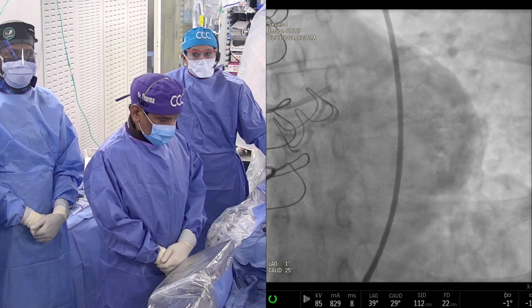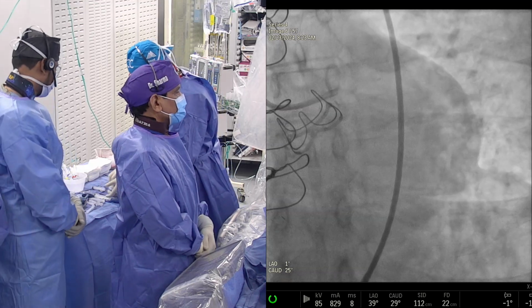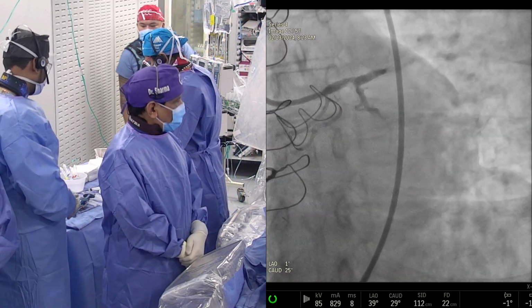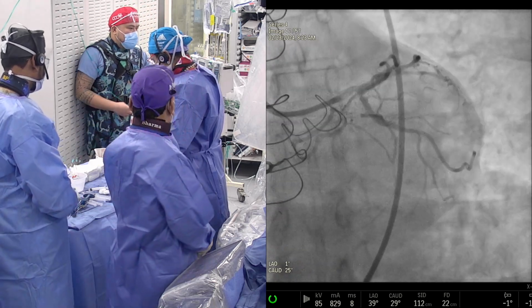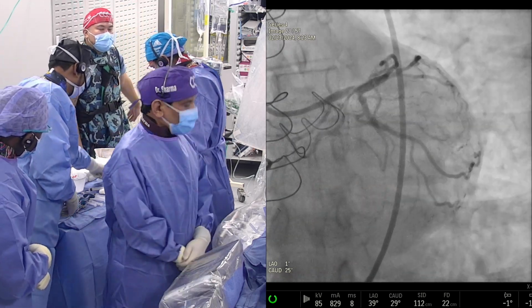Agree. So would you not do a burr from probably left main to circ, and then left main to just the left main with a 2.0? Putting that wire into the LAD? I think that's a reasonable approach: we can do a 1.5 burr into the circumflex and then do a 2.0.